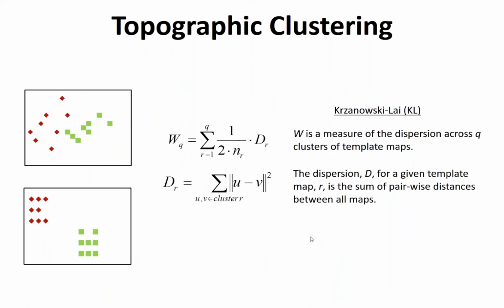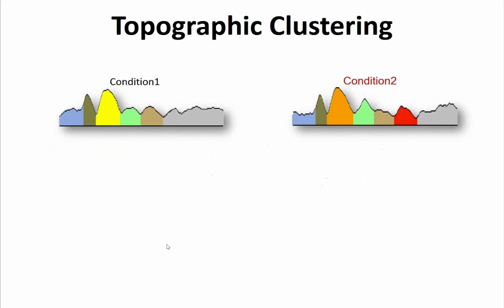One of which I illustrate here, which is based on notions of dispersion, which we've implemented in some of our analyses. The basic take-home message, again, I'm trying to target this to newcomers, is what you want are clusters that are wide apart from each other and have very little variance around their centers. And when you do that, you've done a good job in clustering your data.